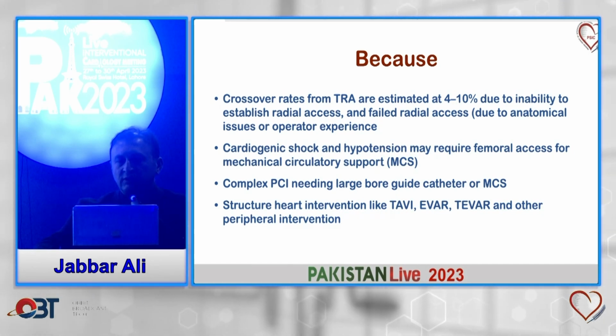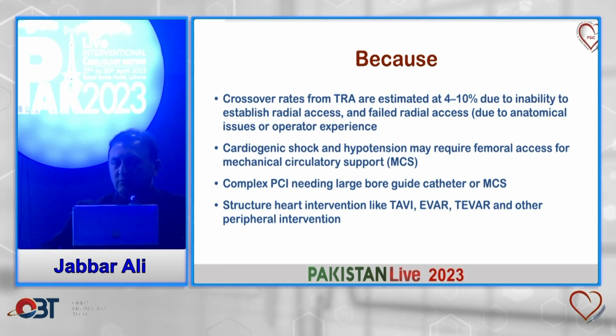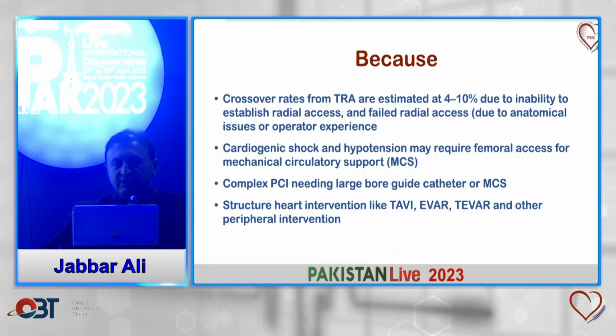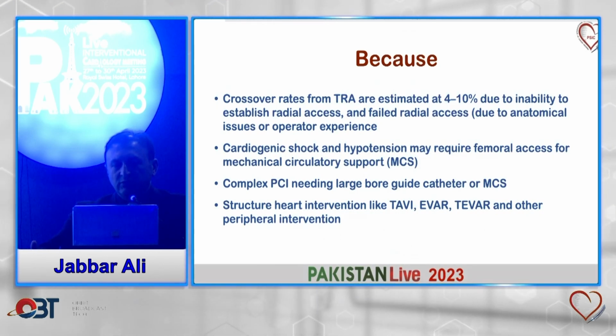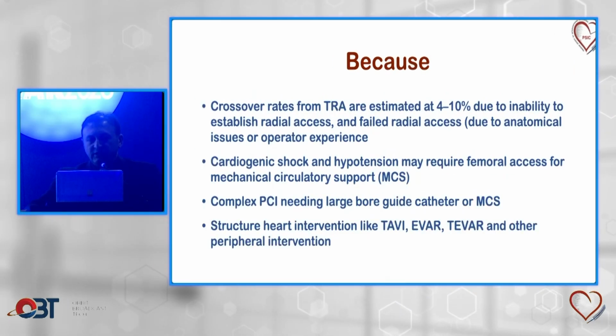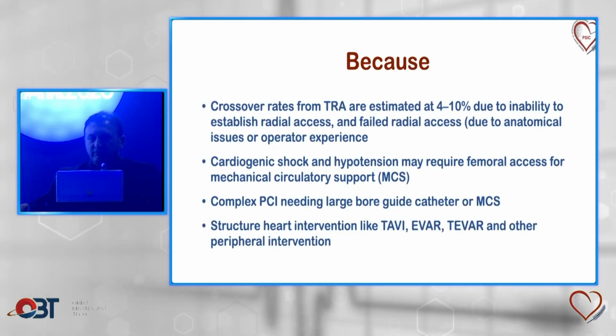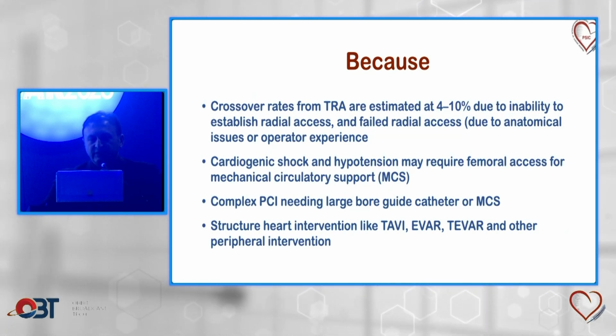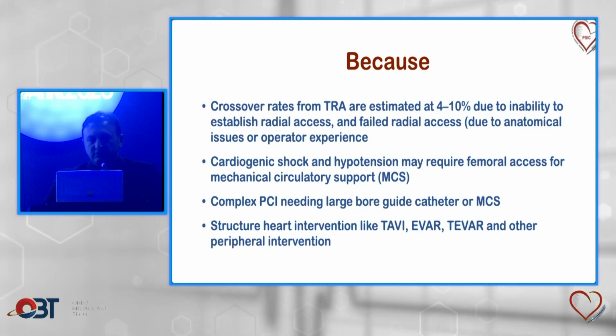In cardiogenic shock and other complex procedures, we may need wide bore catheters. Complex PCI needing large bore guide catheter, MCS, structural heart like TAVI, EVAR, TEVAR. So in these cases, we need a large bore vascular access and femoral is the route to be used.